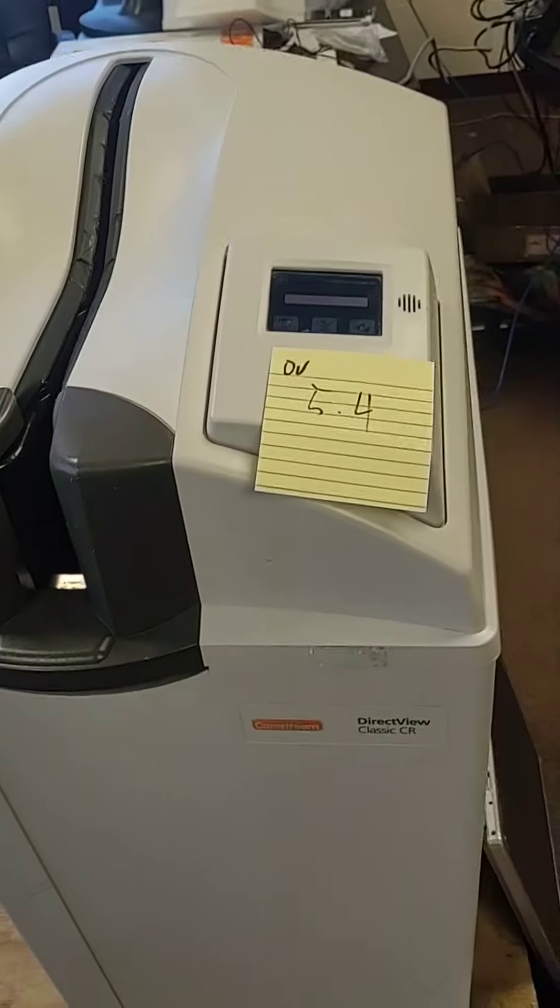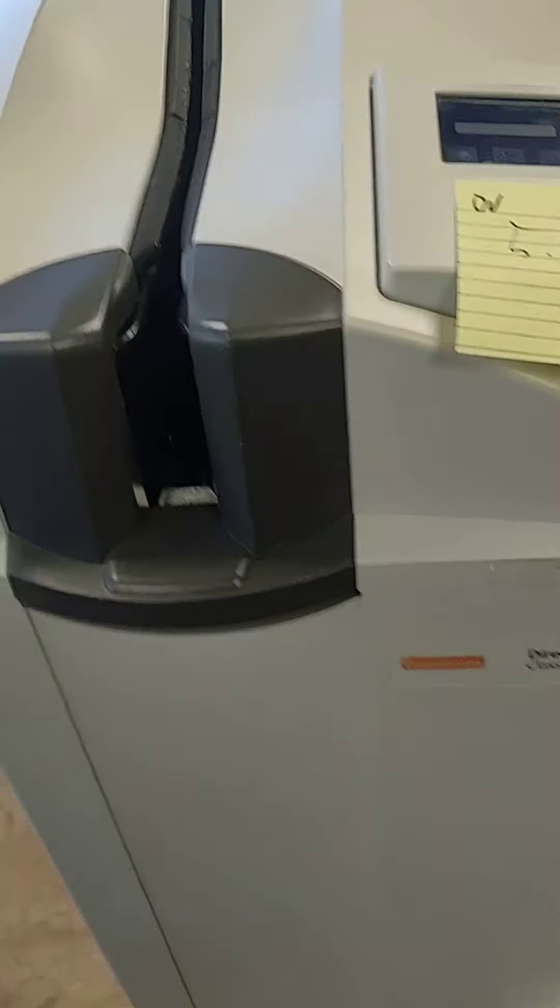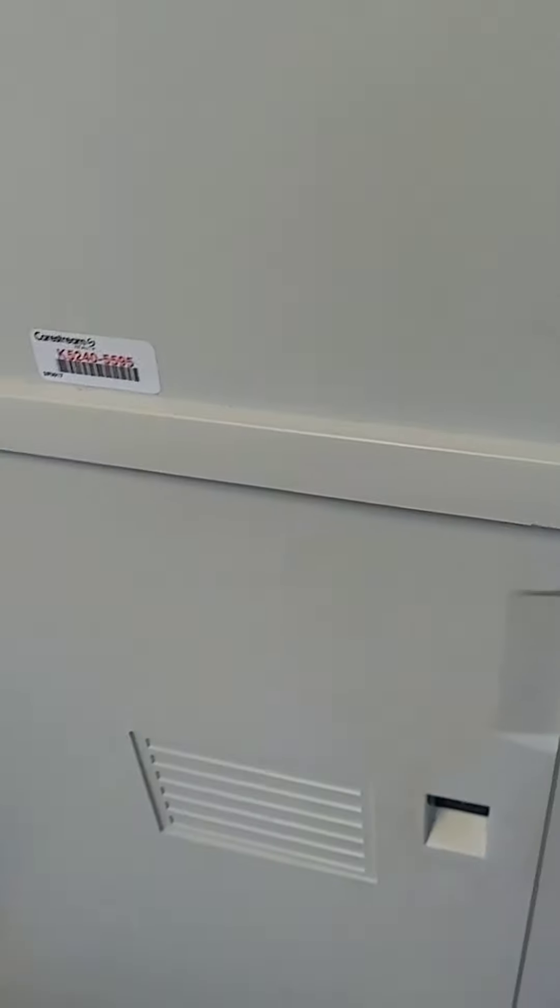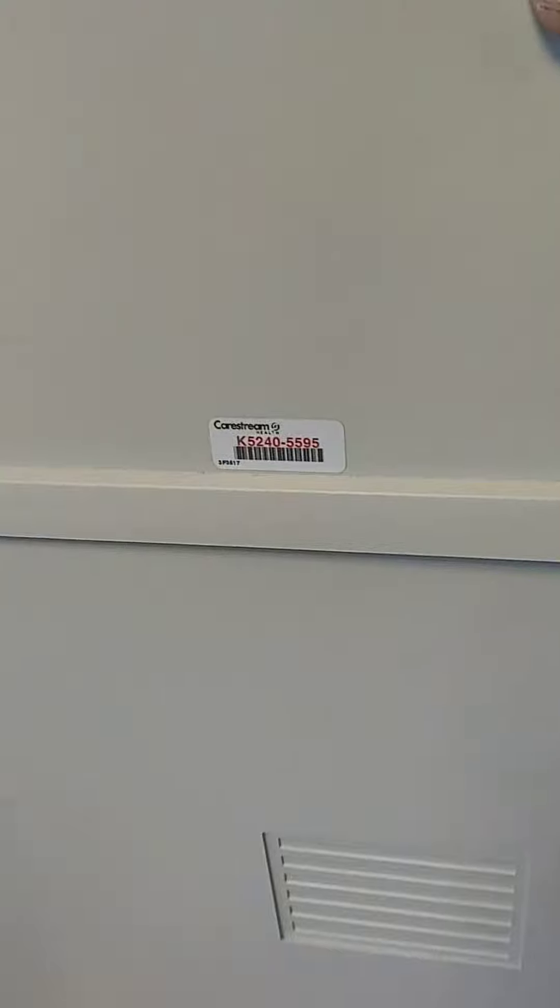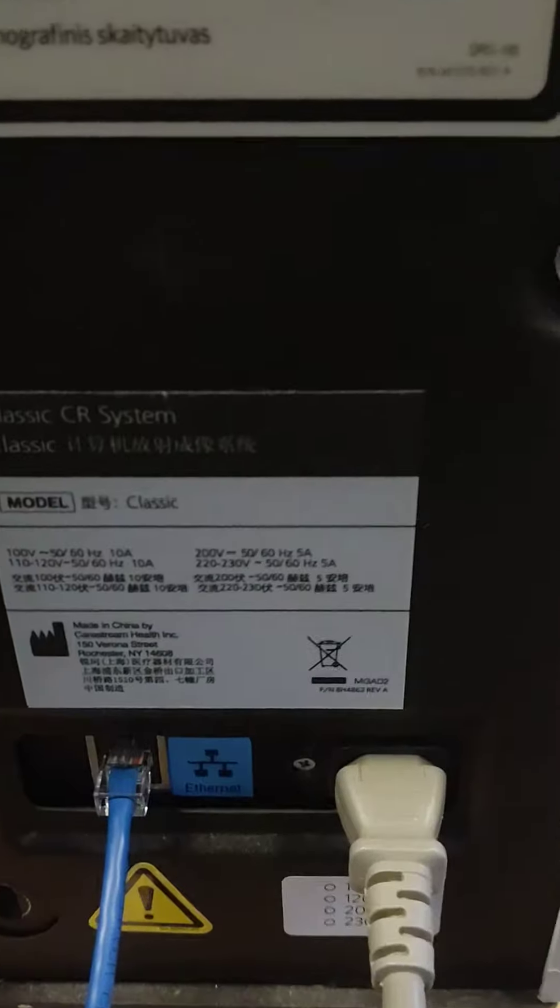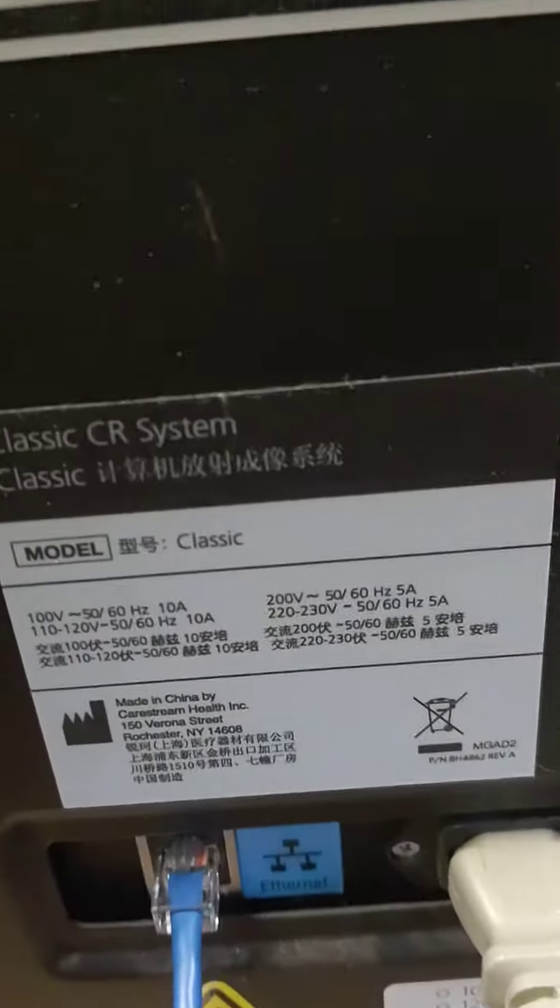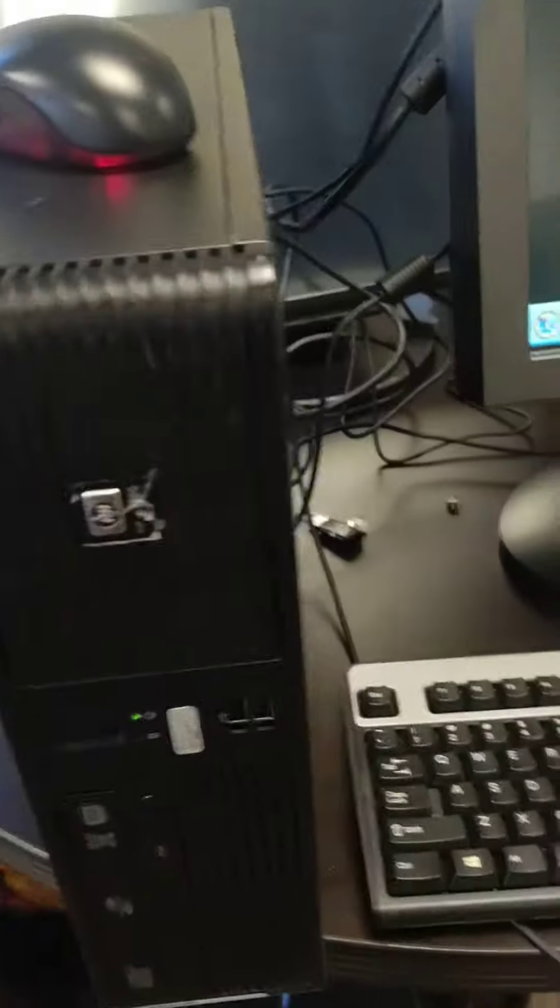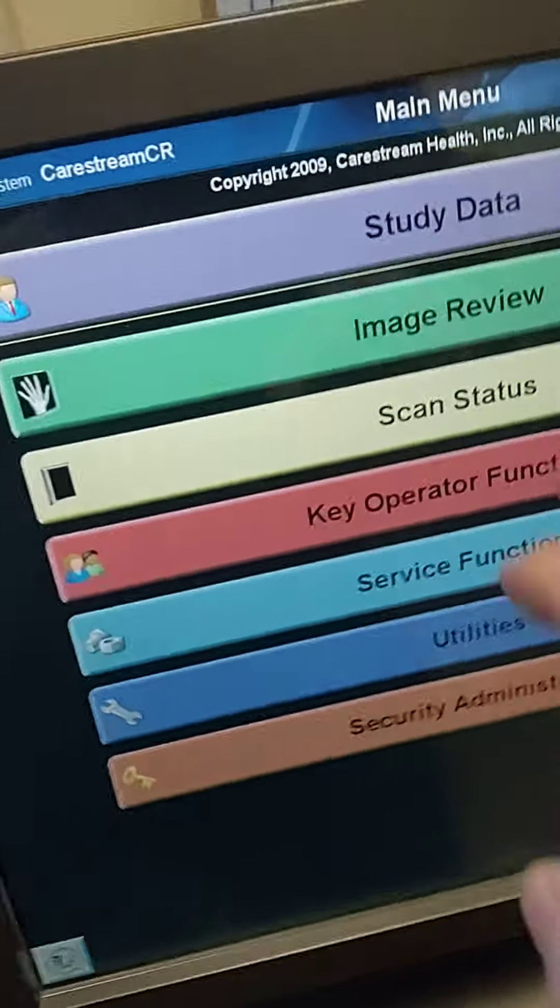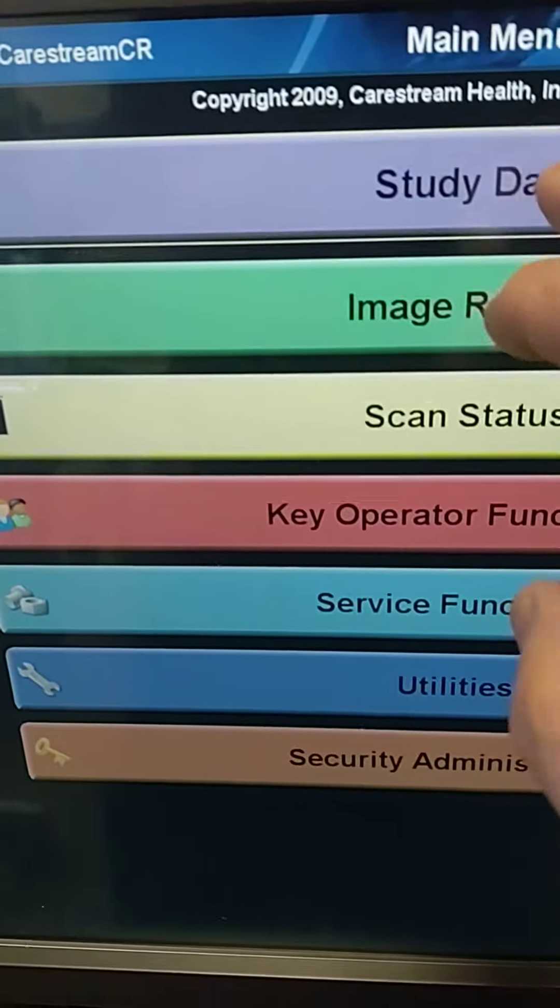This one is unit 2, 5.4 software, Kirsten Classic workstation, monitor. So we're going to do the case.